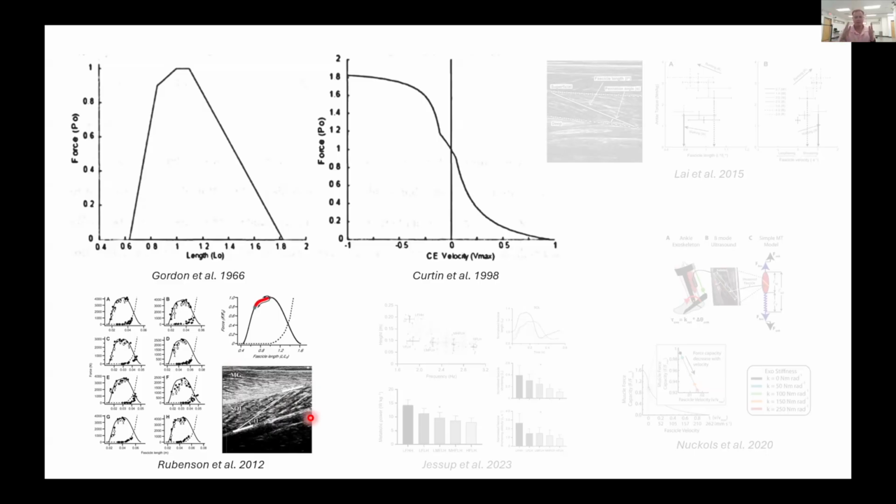And then within the dynamometer, with the ultrasound over those calf muscles, by setting the ankle at different joint angles, changing then the length of the soleus muscle fibers to shorter or longer lengths, and having participants maximally produce force at those different joint angles, they were able to generate force length profiles for the soleus muscle for each of their participants.